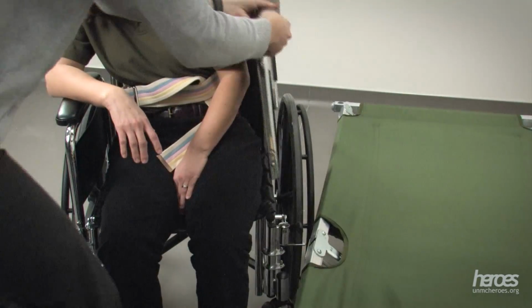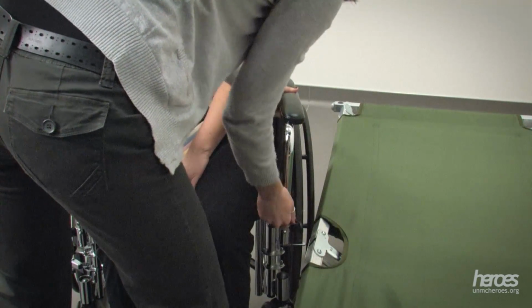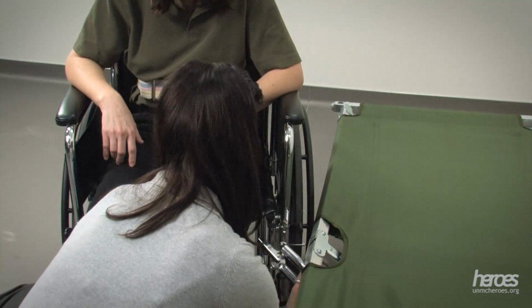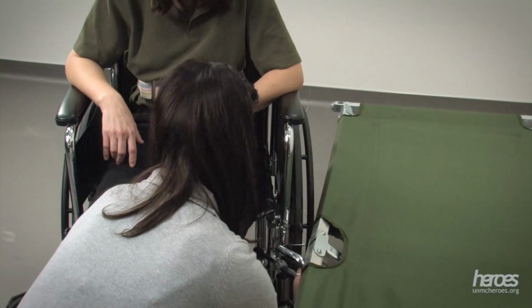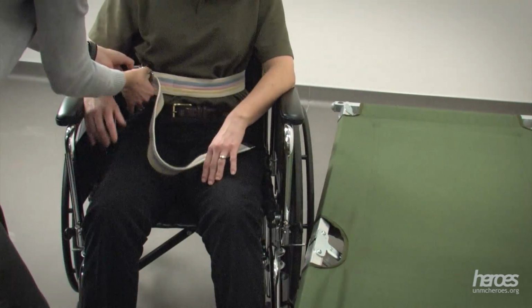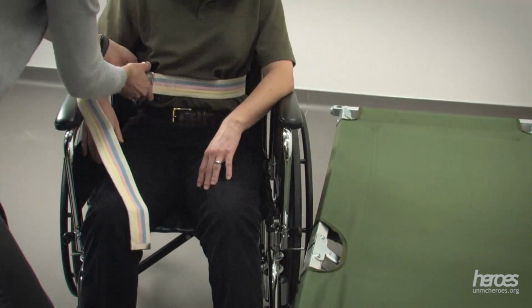Next, replace the armrest and reposition the leg rests for the individual to place their feet on. Then remove the gait belt from the individual's waist and unlock the brakes of the wheelchair.